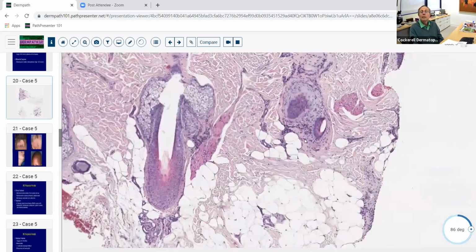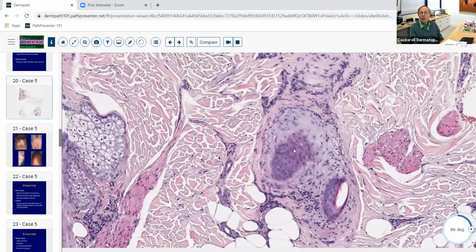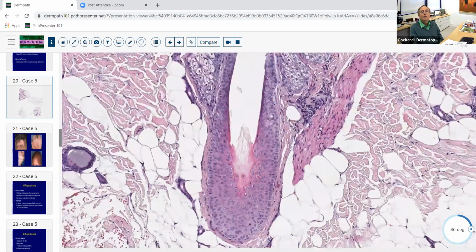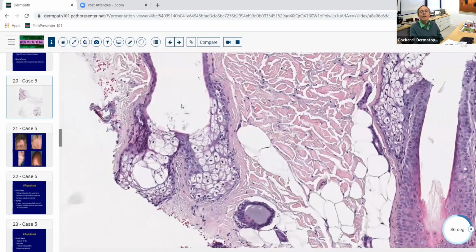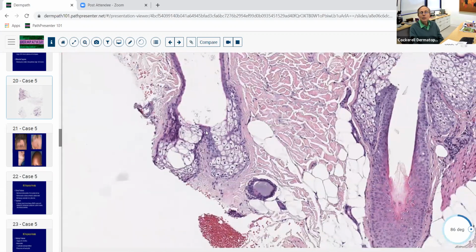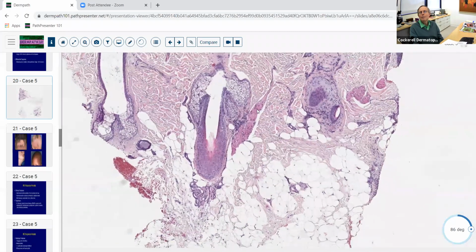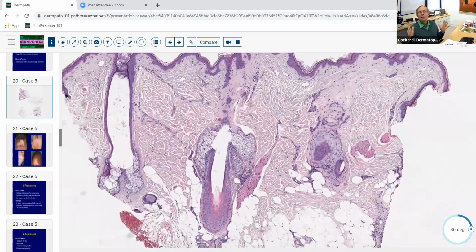So here we don't have a lot of inflammation, don't have any scar, so we're not really dealing with scarring alopecia. We've got what looks like one follicle that's in catagen, another follicle that shifted into catagen. This follicle over here may be kind of late stage catagen, early telogen over here. So there seems to be a synchronization. This isn't as good as some examples we see. Sometimes you see 7 follicles, all of them in catagen at the same time with some inflammation at the bottom of them. If you see that, that's alopecia areata until proven otherwise. You should think alopecia areata if you see that.